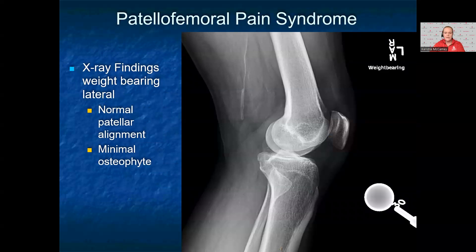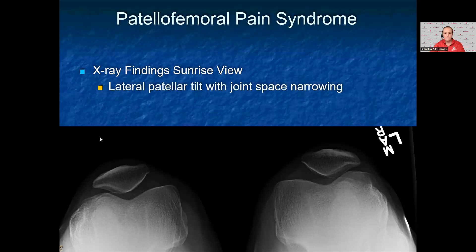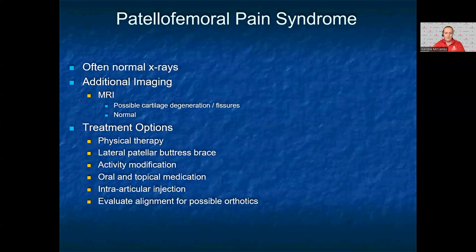In this lateral x-ray, the patient has normal patellar alignment with minimal osteophytes seen in the superior pole of the patella, and narrowing of the patellofemoral joint space. The sunrise view of a patient with the same history shows bilateral lateral patellar tilt with mild lateral joint space narrowing. Both of these are consistent with patellofemoral pain syndrome.